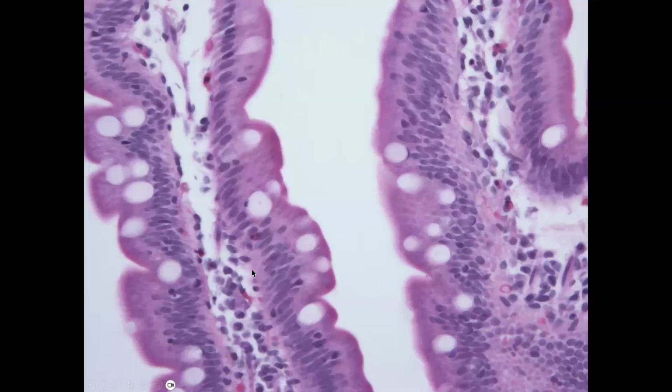And so there are maybe a few lymphocytes. Here's one here. They're a little bit darker, and they have kind of a clearing around them. Here's another. So you can see a few lymphocytes in here, but not really many. You kind of have to look around for them. And so this is the normal appearance of the duodenum.